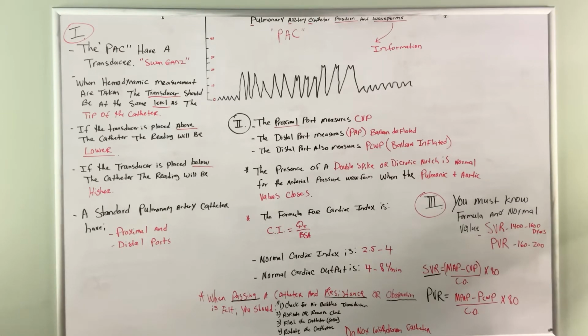Tonight we'd like to talk about pulmonary artery catheters. Particularly, we'd like to talk about these two things: the positioning of the catheter and the waveform. I drew, to the best of my ability, a waveform at the top center of the board to give you an idea of what you will be looking at on the exam.